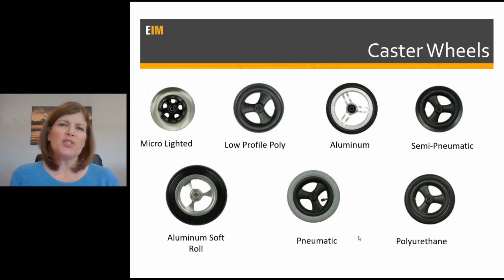When we're thinking about caster wheels, we can think about the different choices there. So when you look on an order form or look at a manufacturer's website, you'll see some of the choices include things like micro-lighted, which are very popular with the pediatric population. But this is a very hard material, and we'll see later that it actually has a beneficial effect on rolling resistance.